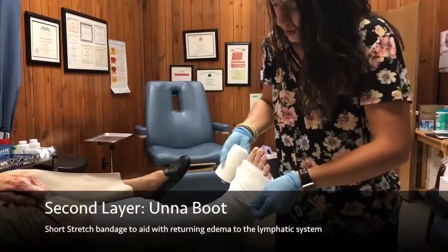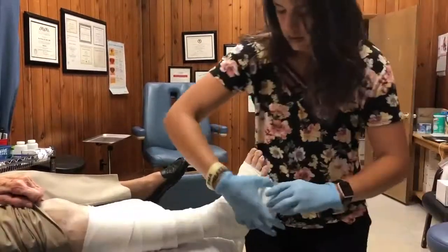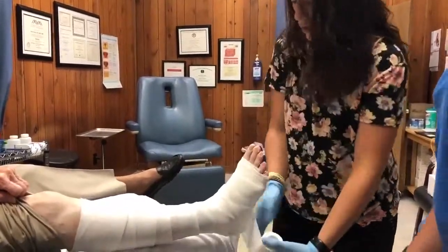The second layer is an unaboot, which is known as a short-stretch bandage, which will aid with returning edema back into the lymphatic system.